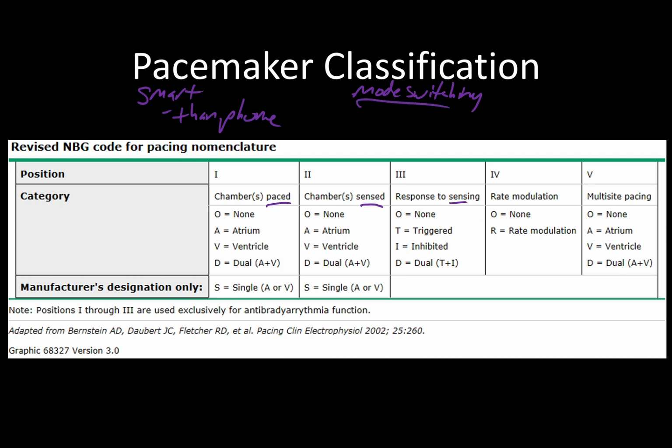And mode switching is really neat because it actually changes its function based on what it sees in terms of your native response. So let's just say it's set to pace you all the time. But if your natural heart is able to pick up the pace and is working well enough, then it actually kind of shuts itself off so that you don't pace when it's not necessary.